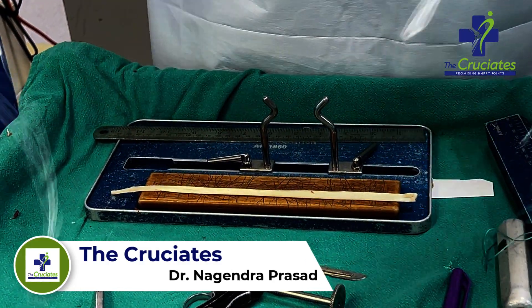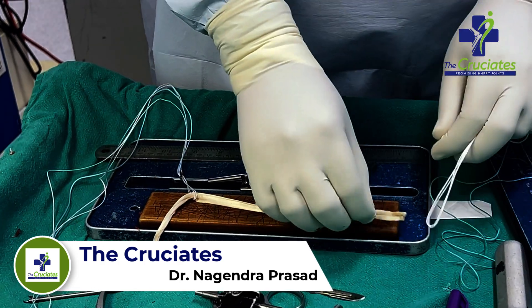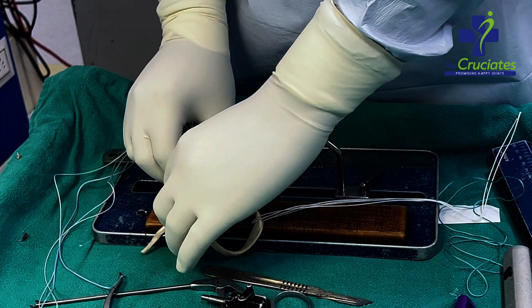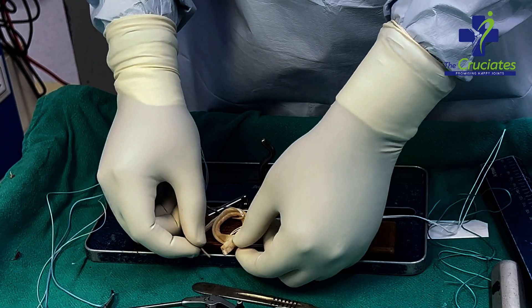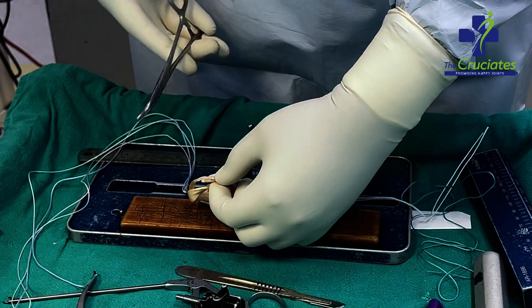After this, I pass an adjustable tight rope from one end and an ABS loop from the other end. Again, the graft end is passed through the tight rope and ABS loop in a clockwise manner. Then graft ends are overlapped by a minimum of 2 cm and sutured together with fiber wire.